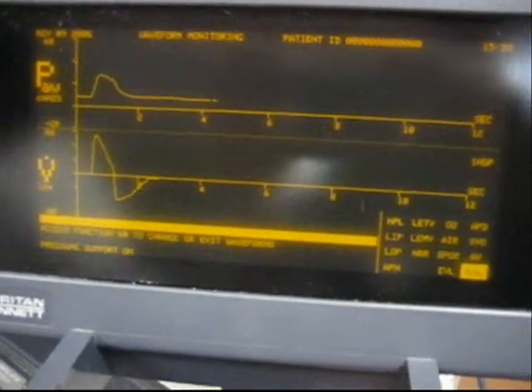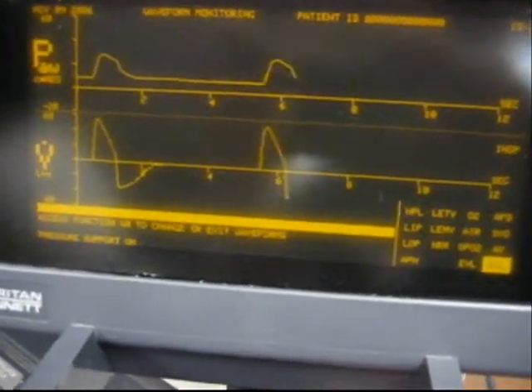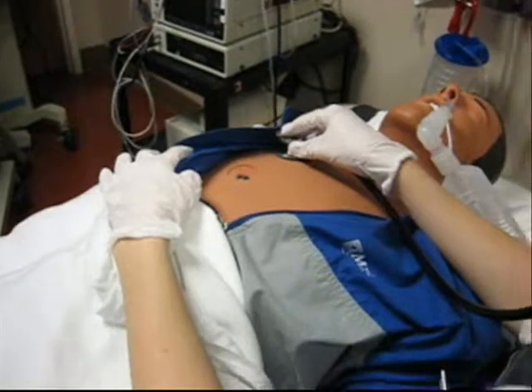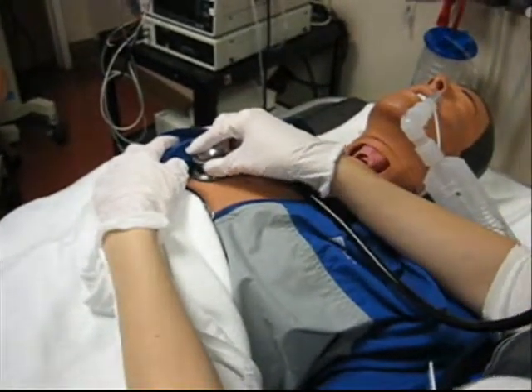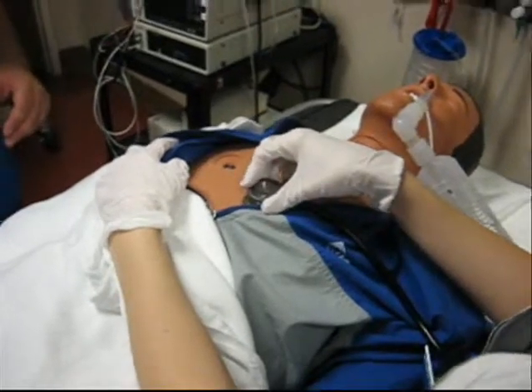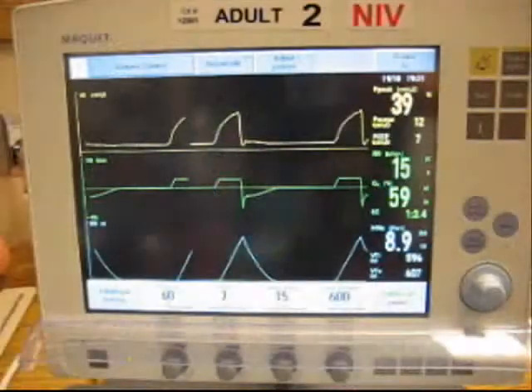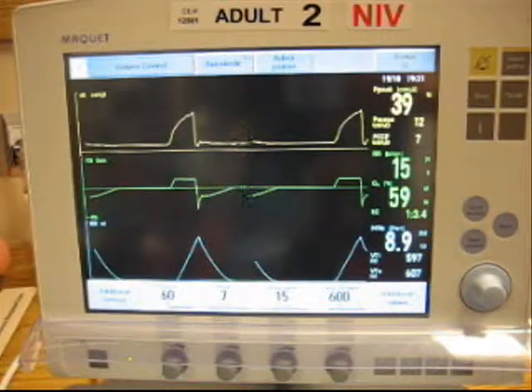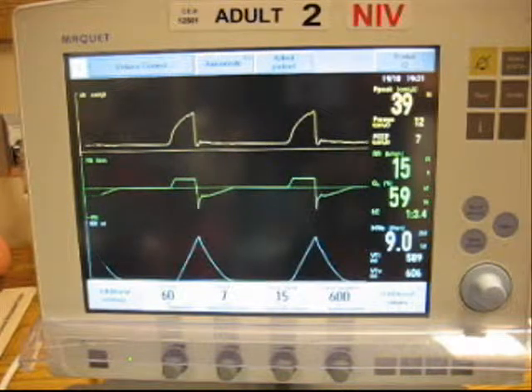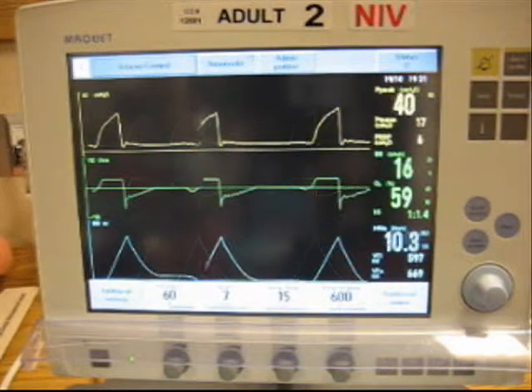This may be done by quickly evaluating the scalars where possible, or by looking at the pressure manometer on the ventilator. A quick auscultation of the patient over the chest fields and the epigastric area is warranted at this time. Position the circuit appropriately and establish any bedside monitoring that is required, such as end-tidal CO2 and oximetry.